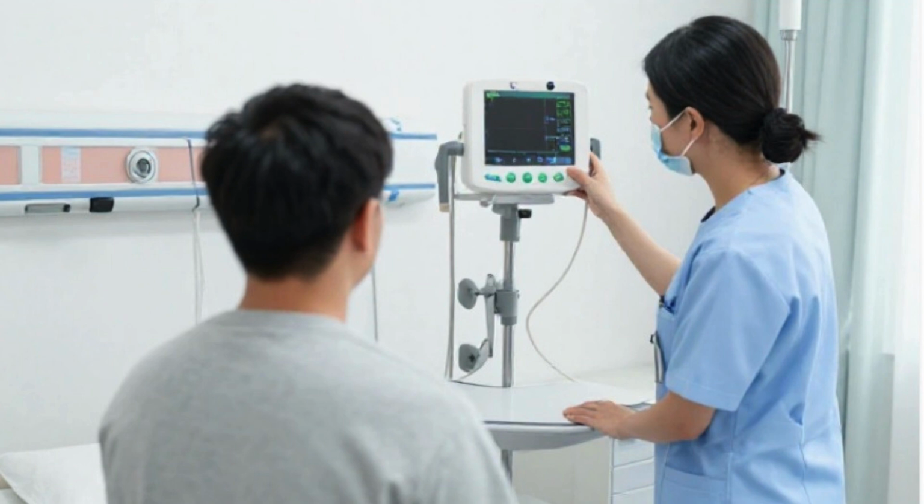11. What problem can occur if alarms are not properly configured? A. Signal amplification failure. B. Alarm fatigue. C. Network disconnection. D. Battery overheating. 12. What is the difference between bedside and central monitoring systems? A. Central monitors are used only in ICUs. B. Bedside monitors cannot display waveforms. C. Central systems monitor multiple patients at one location. D. Bedside monitors do not use alarms.